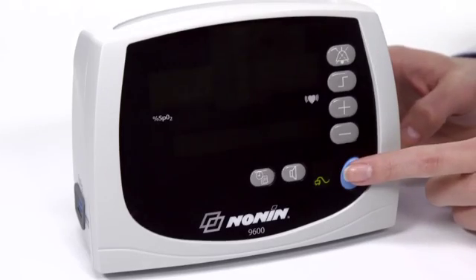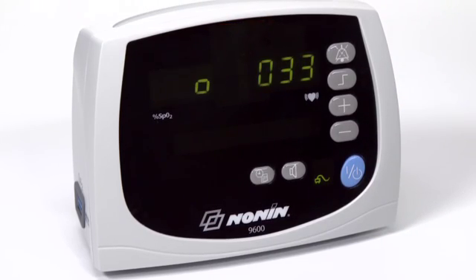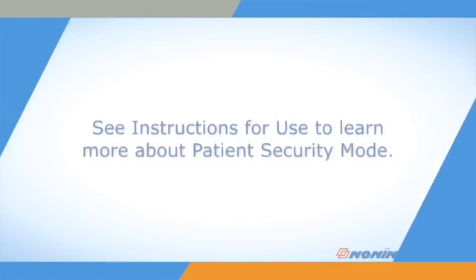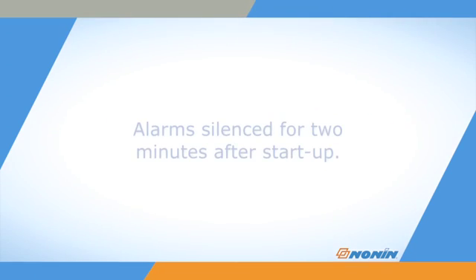A patient security mode prevents changes to alarm limits and a number of alarm and functional settings. During start-up you will see the software revision PS_DFL, meaning patient security mode is enabled, followed by the upper and lower alarm limits. Refer to the instructions for use to learn how to set or cancel patient security mode or reprogram settings. The alarms are silenced for the first two minutes after starting the unit to allow time for adjusting settings and connecting the sensor to the unit.